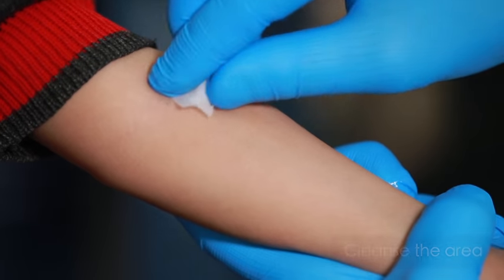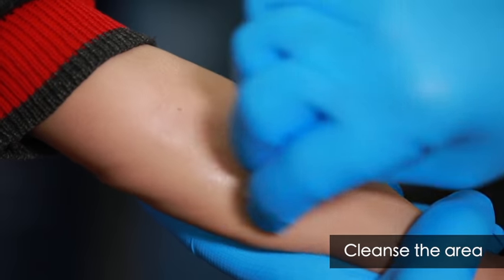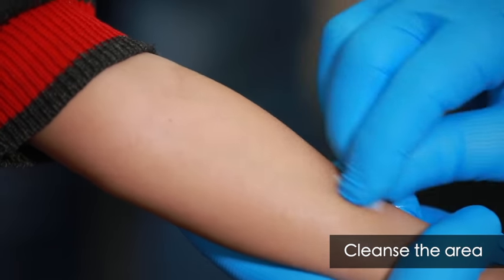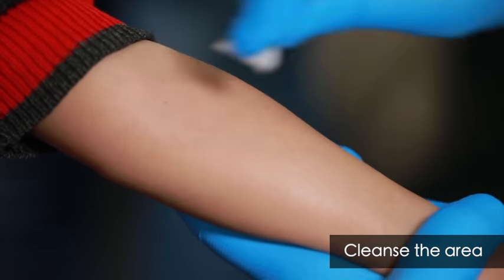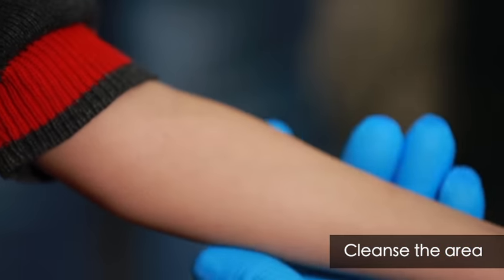The Mantoux test is the recommended TST. It is to be given on the volar surface of the forearm. Cleanse the area with an alcohol swab and allow the area to dry.